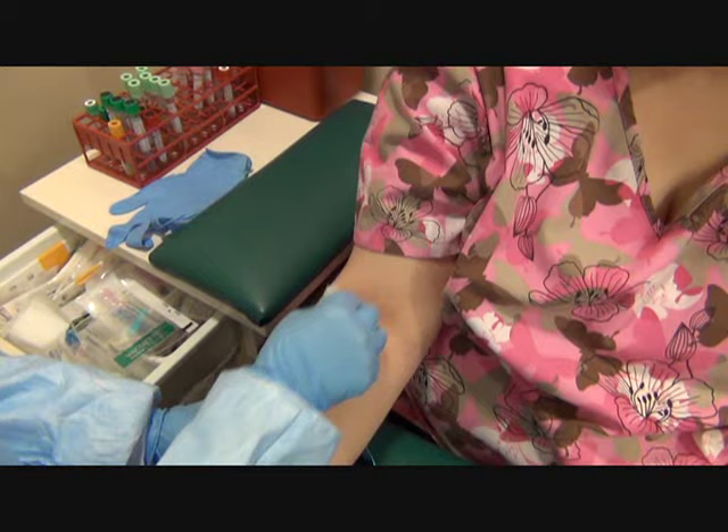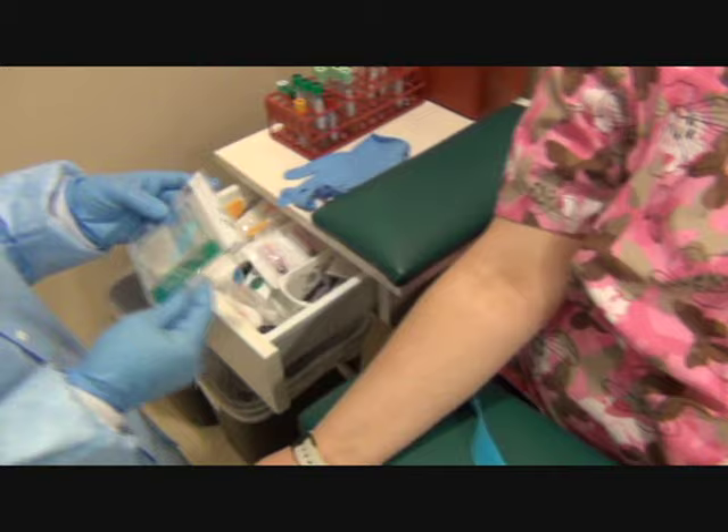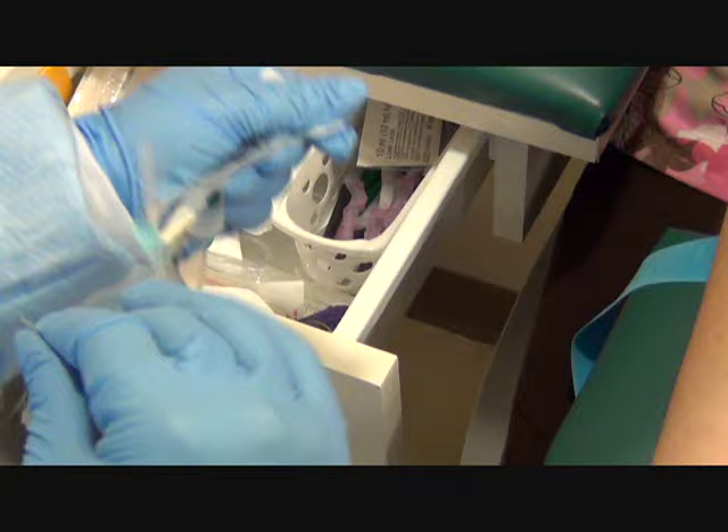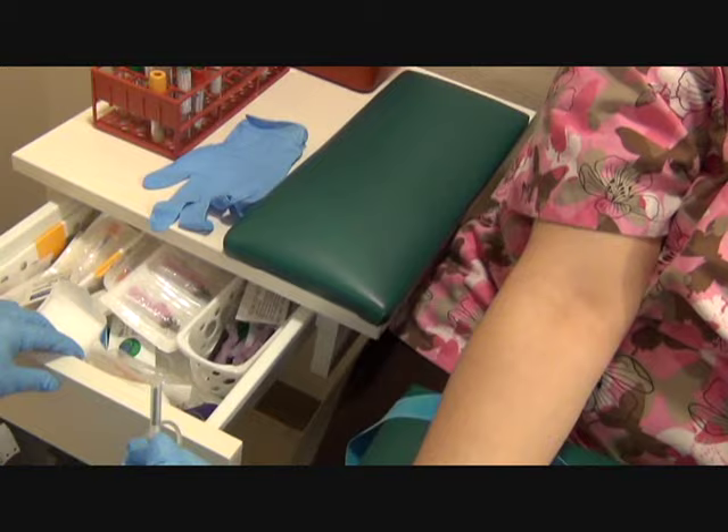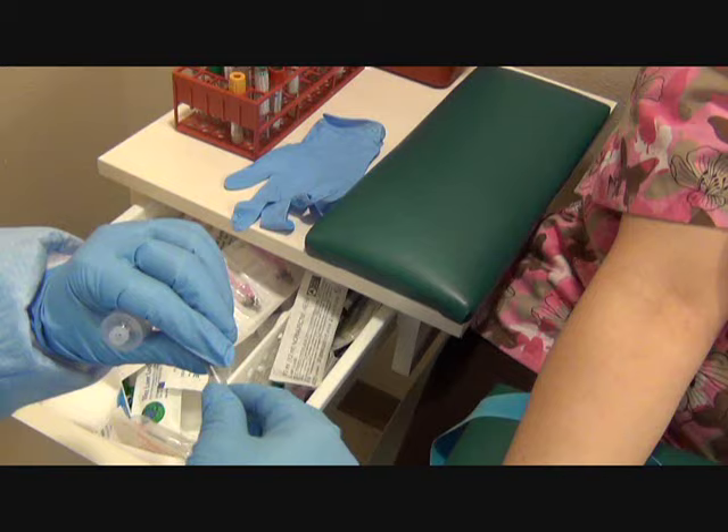I'm going to use the vacuette butterfly. This one will be activated in the arm. It was in the packaging so I want to make sure I stretch out my tubing. I'm going to use the ETS method so I need a hub. I can also use this with a syringe.